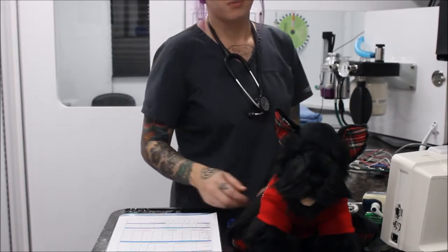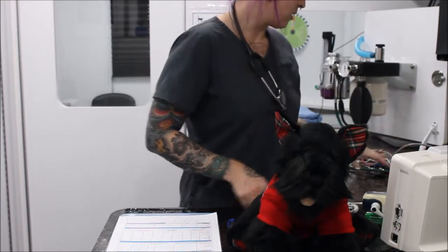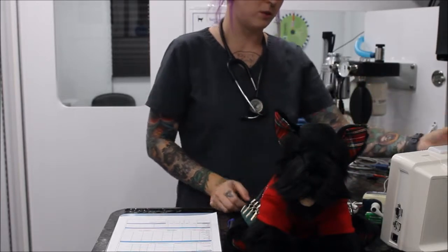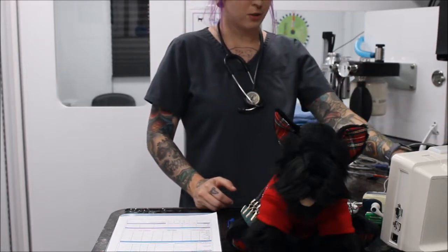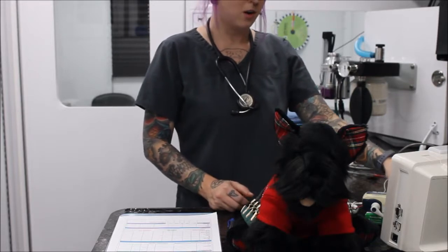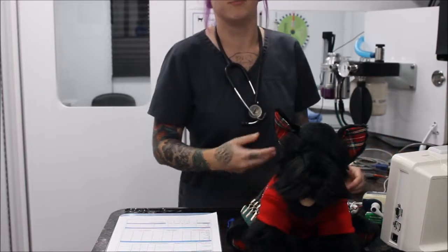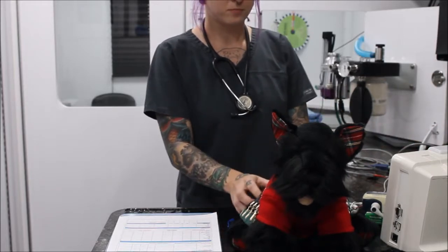So the next thing we're going to check is the heart rhythm. Heart rhythm is usually monitored through the ECG, and so when we have our ECG leads hooked up to our patient, we monitor it here on our universal monitor. It has different functions, but what we want to look for are smooth, regular patterns and smooth, regular beats in the heart. We don't want to see anything sporadic. Sporadic could tell us if there's an arrhythmia or some kind of block. We just want to make sure the pattern stays nice and even and steady.